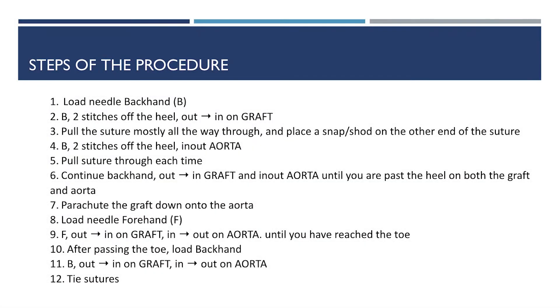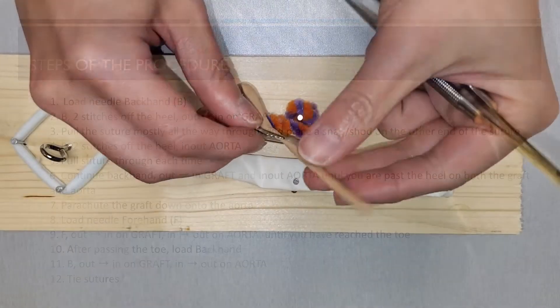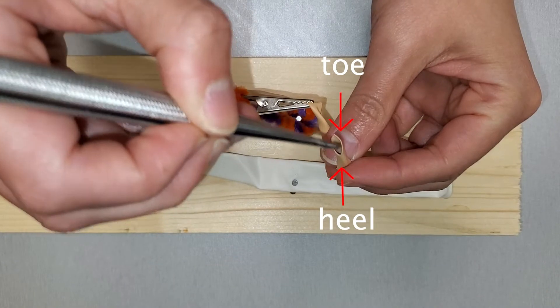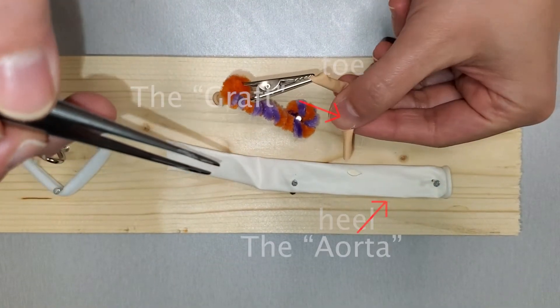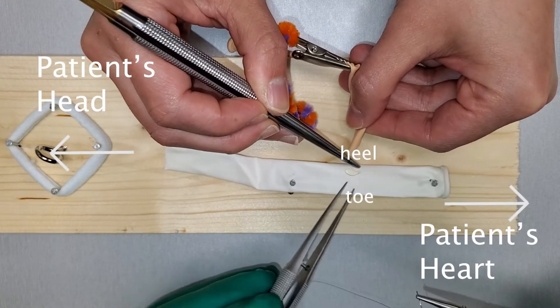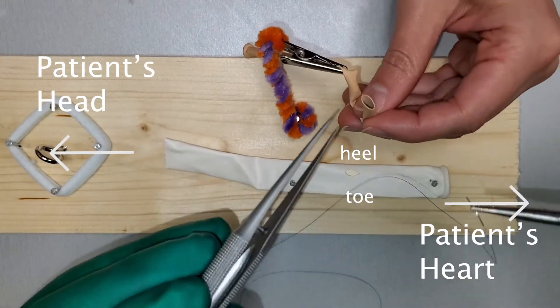Here are the steps of the procedure — please refer back as needed. So we see that this is our graft. This is the heel, here's the toe. When we put it on the aorta, we'll put it on this way — so this is the heel, here's the toe — and that means you have to go two off the heel right there.